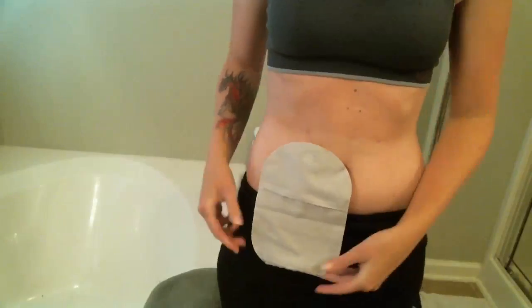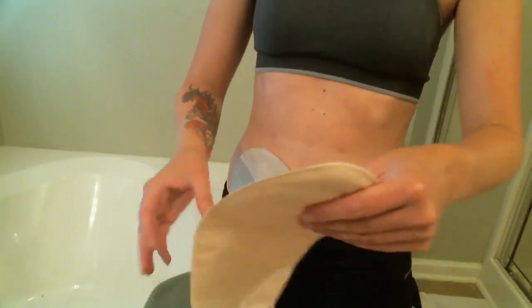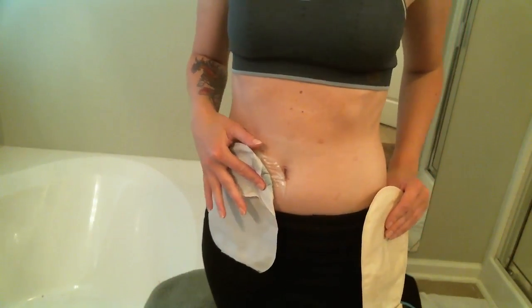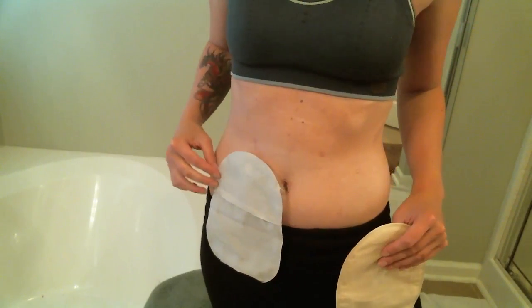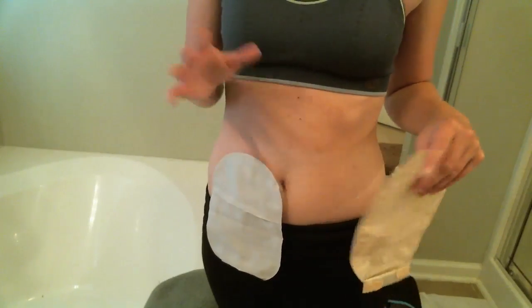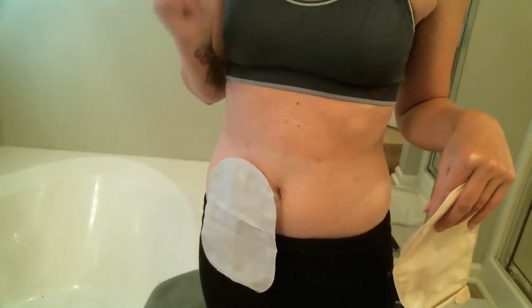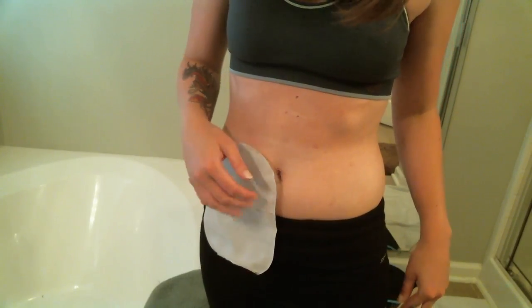And so here, you can see it here. Looks fairly typical. But as you can see, this is a one-piece bag, which I don't actually usually wear. I tend to have issues with them, and I have leaked in the past when I use one-piece pouches. I actually use the Flex, which is a two-piece, but it doesn't have the snap. It actually just sticks together. But they do not currently have those out yet in this Sensura Mio, so I thought I'd try out the one-piece just to give it a go.